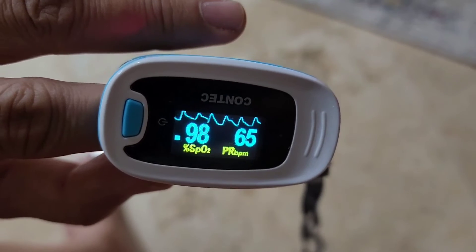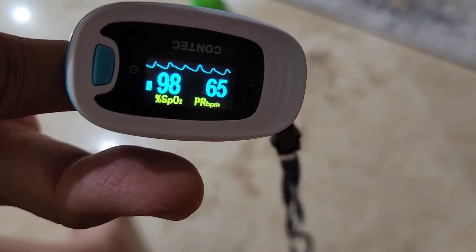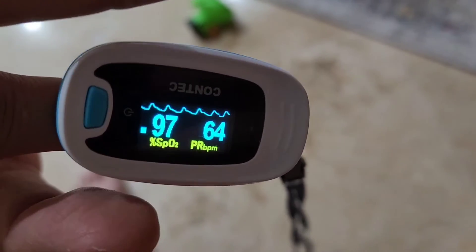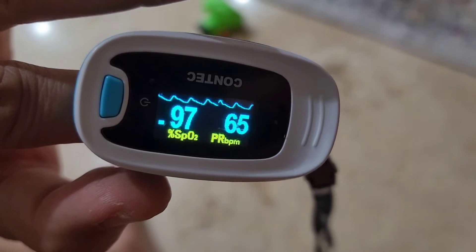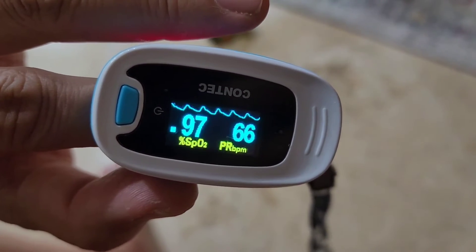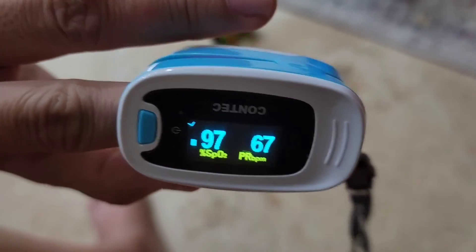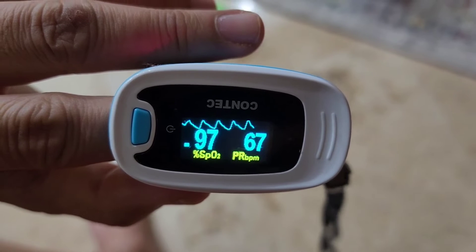From what I've seen here, you can see the SpO2, which is oxygen levels, and over here your heart rate. Up on top it's got a little graph that can show what they call sinus rhythm — your heart rate and whether it's consistent beats. I'm going to show you a video clip from when I was in AFib so you can tell the difference.